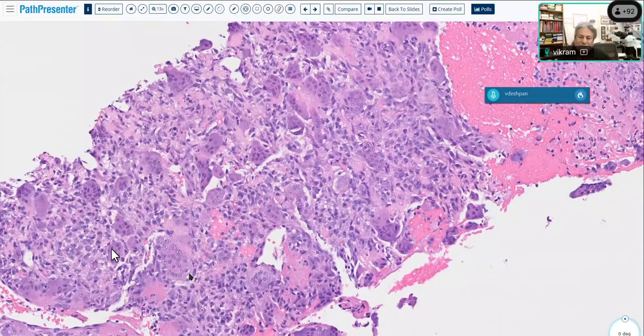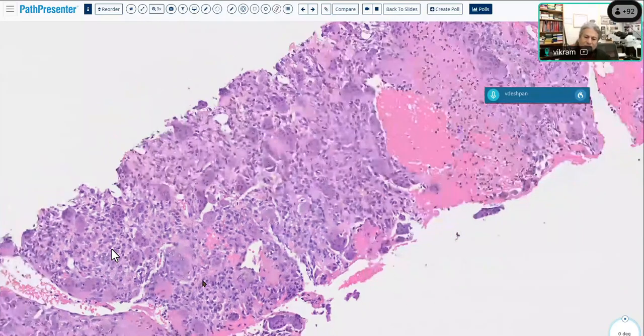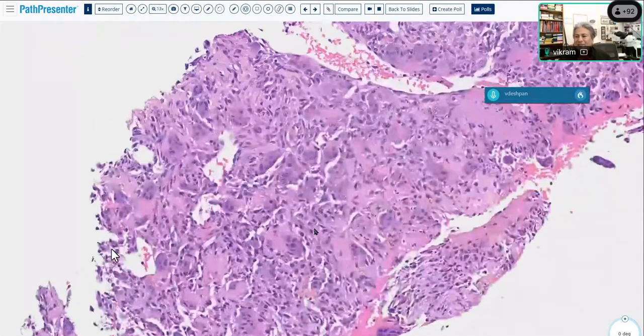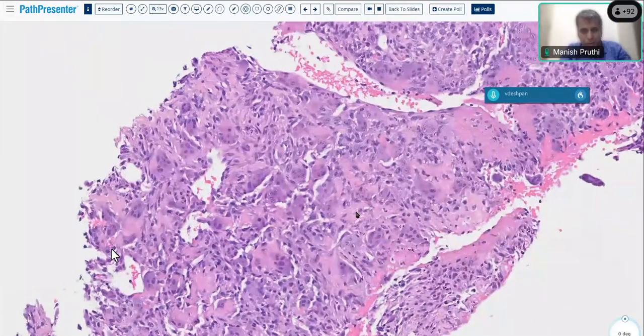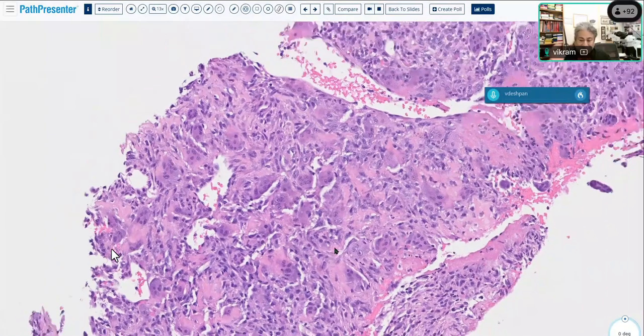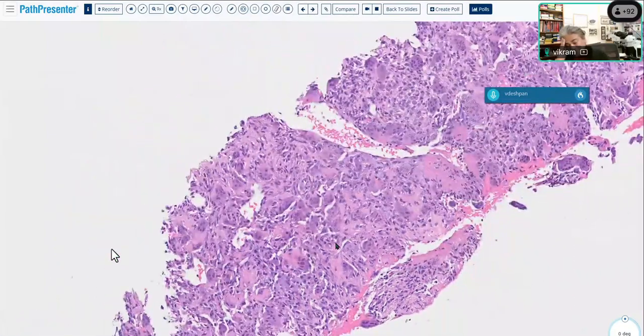So what did I do next? Alkaline phosphatase. Yeah, but sometimes this brown tumor kind of picture can also confuse us. So a brown tumor, that's a very good differential diagnosis. And I did ask, there were no other lesions elsewhere, and I can't remember what the alkaline phosphatase was.